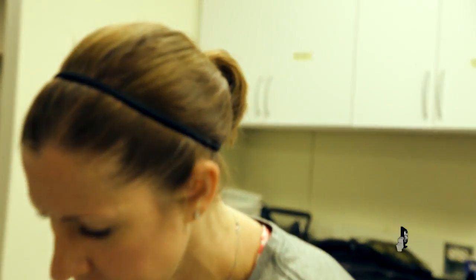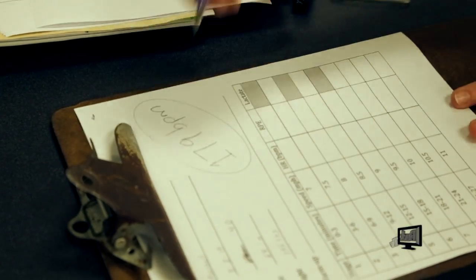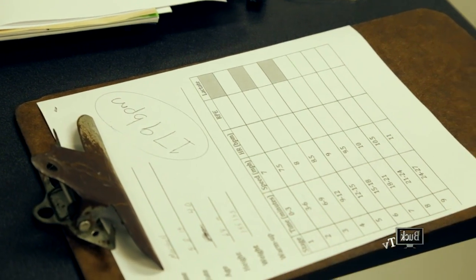And he's 41, so his age predicted max heart rate is 179. Is he 41 or 40? He had a birthday? Marshall, you said 41. All right, so his age predicted max heart rate is 179. So that's another little piece of the puzzle in the back of our head. It doesn't mean that his test won't end at 170, and it doesn't mean that his test won't end at 186. It means that's a ballpark for us, right? It's a ballpark for us to say when he gets close to or at his age predicted max heart rate, he's probably nearing maximal exertion. But again, it's just an estimate, so it's not perfect.